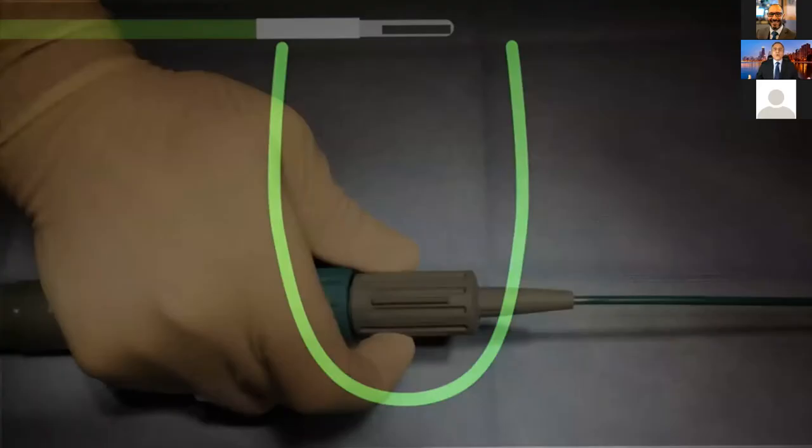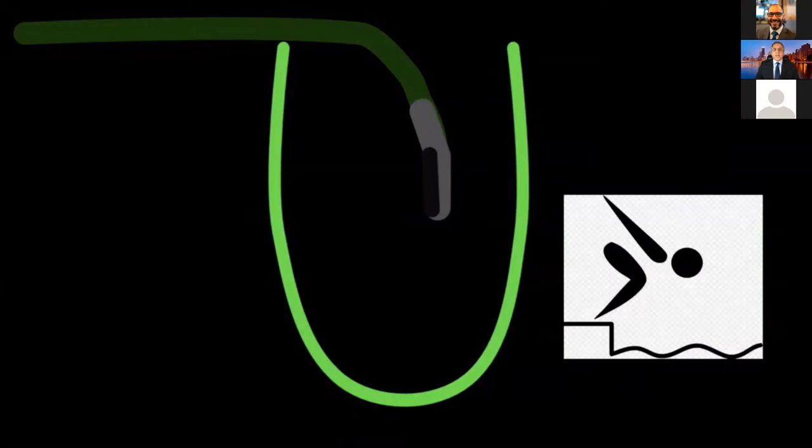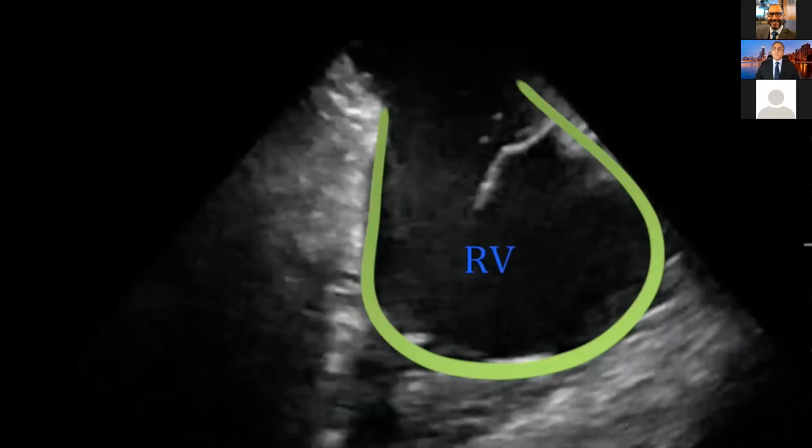How do I go into the right ventricle? Anterior tilt. You always perform anterior tilt, getting a diving motion inside the right ventricle — you literally dive with the anterior tilt. When you dive into the right ventricle, remember those two dots are always going to be horizontal on top. You are not making the right ventricle horizontal — you are seeing the right ventricle horizontally because you know your ICE catheter is inside the right ventricle.